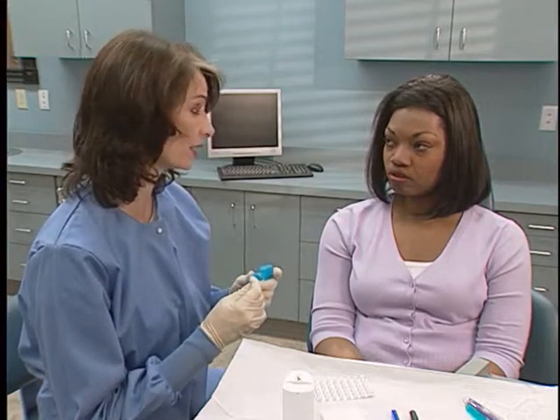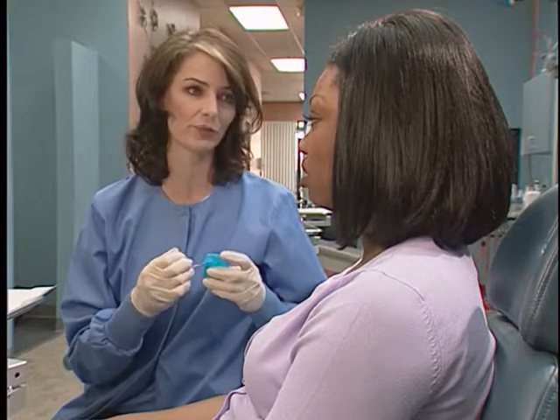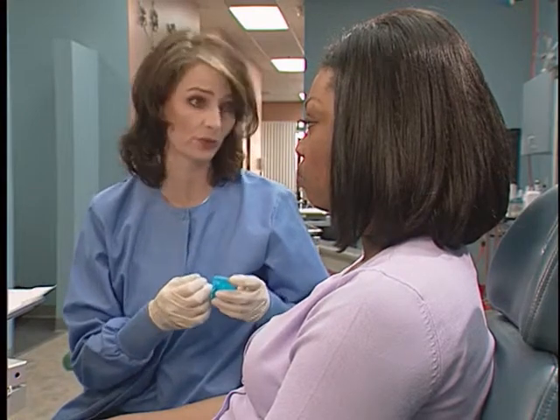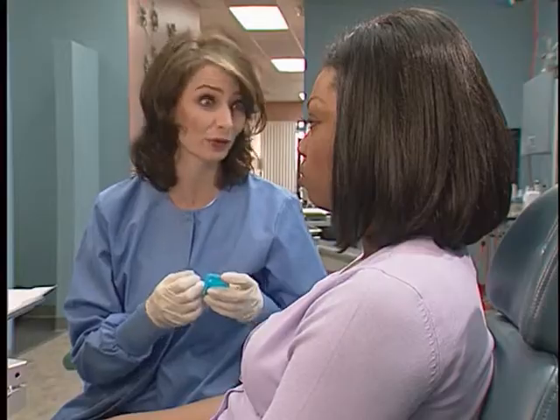Flossing is one of the most important parts of taking care of your teeth, especially when you're wearing braces. It might be a little cumbersome at first, but with practice it really will go much faster. You might want to make it part of your routine just before you go to bed. That way you'll have plenty of time to do a thorough job.